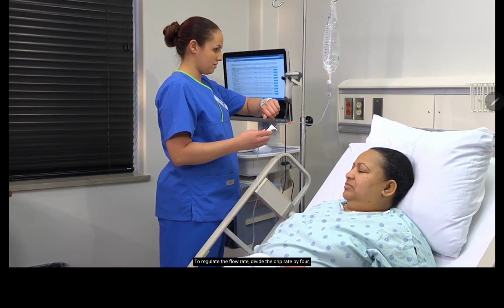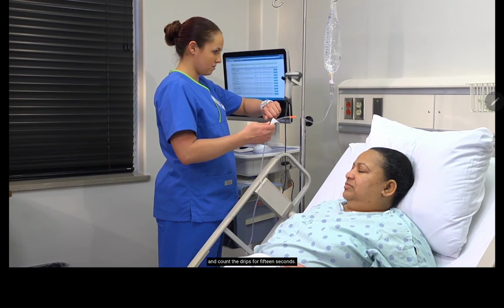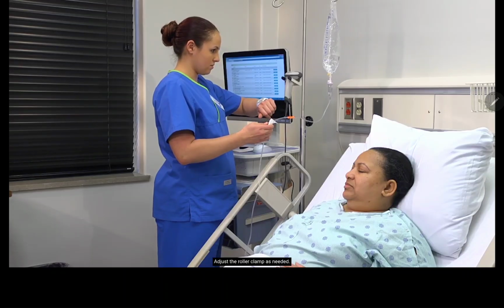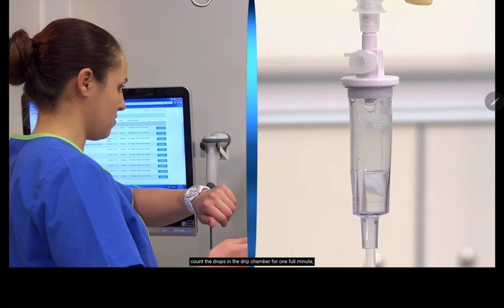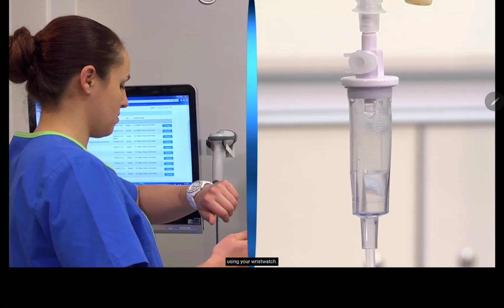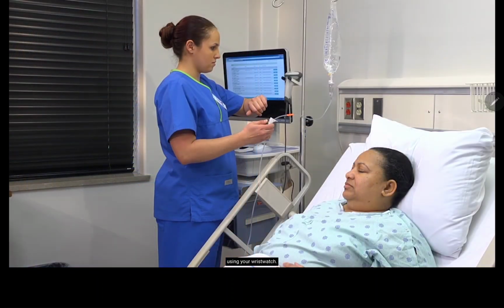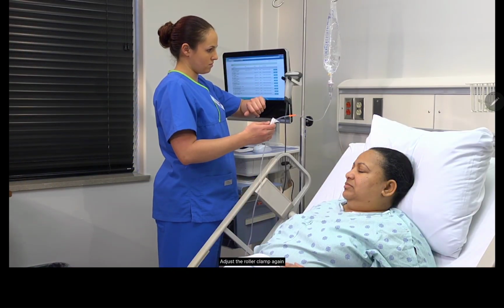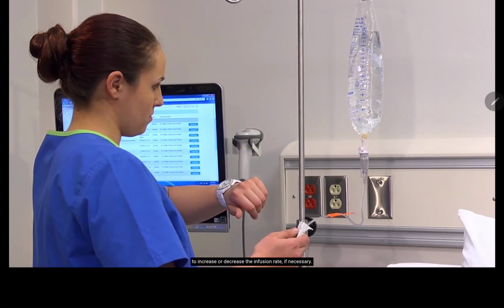To regulate the flow rate, divide the drip rate by 4 and count the drips for 15 seconds. Adjust the roller clamp as needed. When the rate appears to be accurate, count the drops in the drip chamber for 1 full minute using your wristwatch. Adjust the roller clamp again to increase or decrease the infusion rate if necessary.